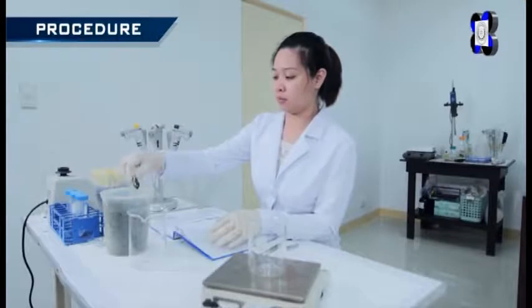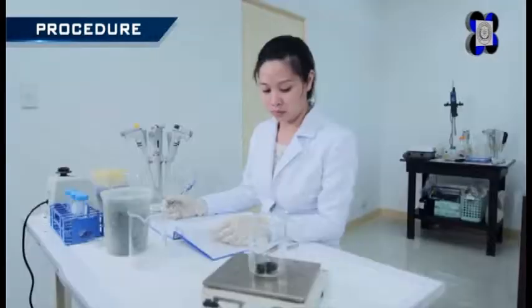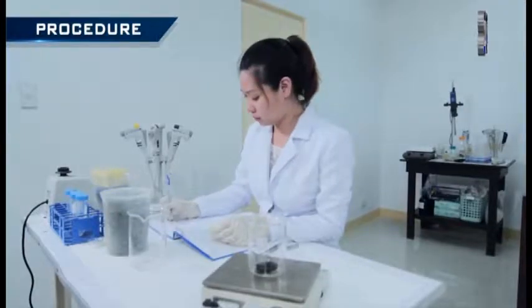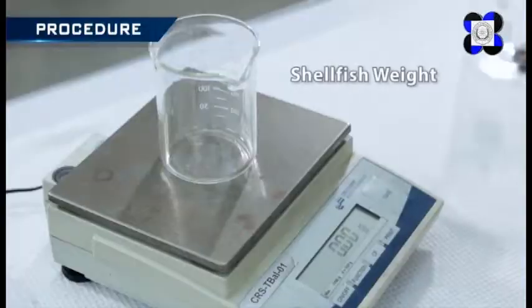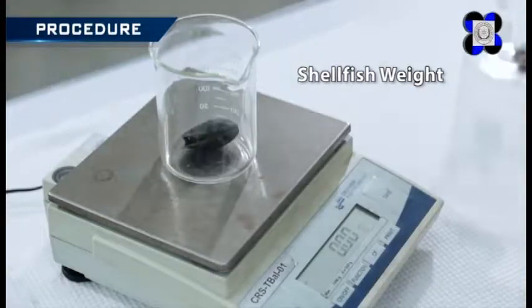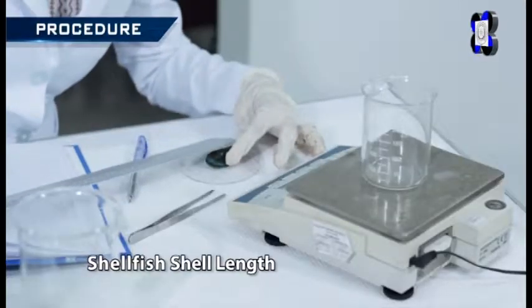To extract the saxitoxin from shellfish samples, collect all samples to be analyzed, noting all individual dimensions like the total shellfish weight, shellfish meat weight, and shellfish shell length.